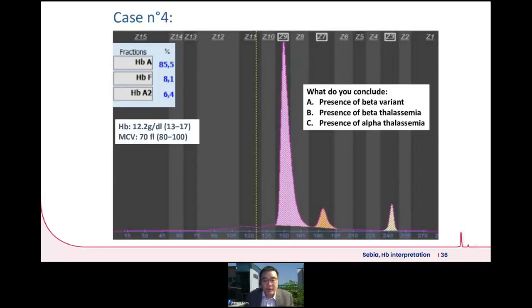How about this case? You see hemoglobin F increased, hemoglobin A2 is increased. This is very unlikely a variant situation. Okay. This is actually the presence of beta thalassemia because of the increased hemoglobin A2.